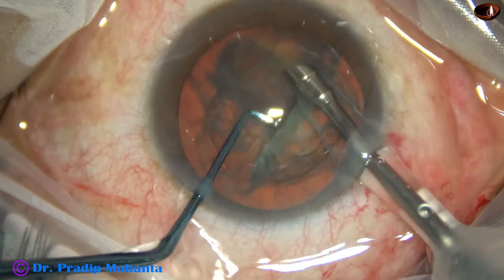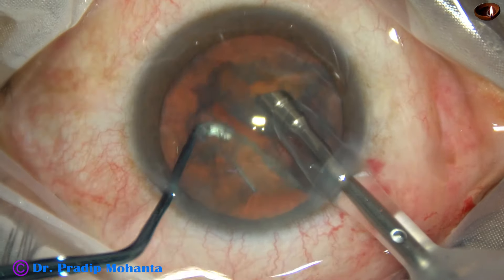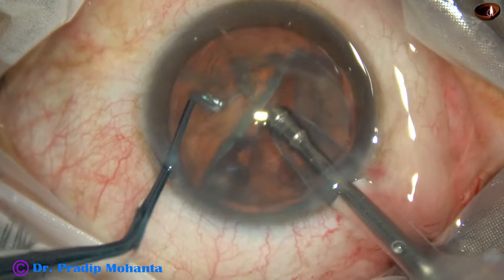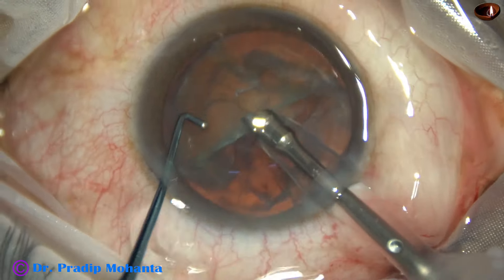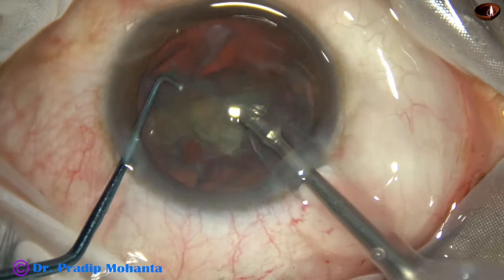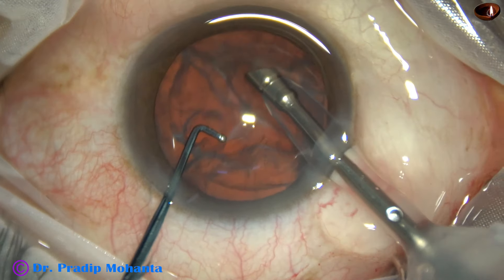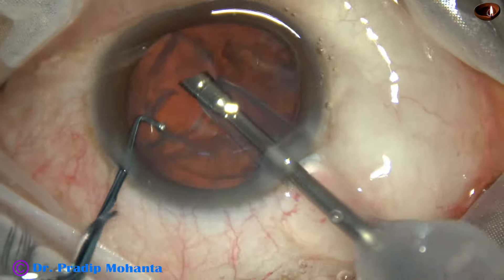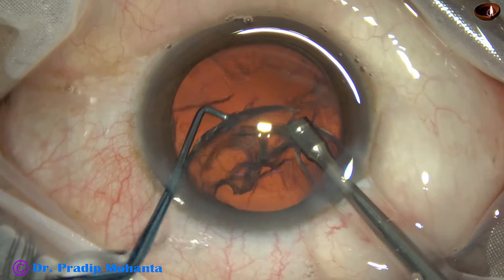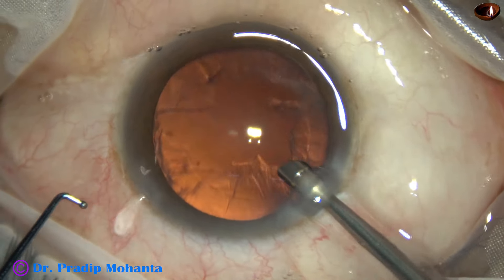The free nuclear piece is emulsified. Then the other nuclear piece is emulsified, and then the hemi-nucleus is held — but I cannot hold it, so it just tumbled, and I start eating it off anyway and it gets over in a few seconds. This kind of cataract, where you cannot hold it and chop it, is exactly where this pre-chop technique is a beautiful way to manage such nuclei.